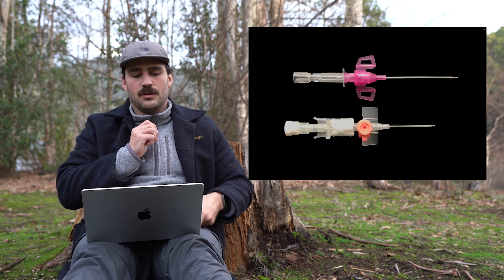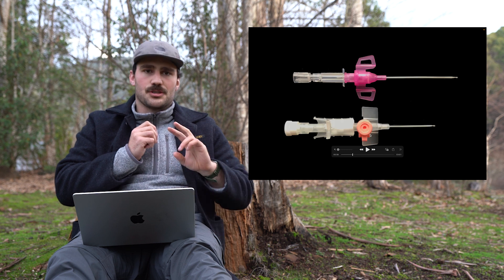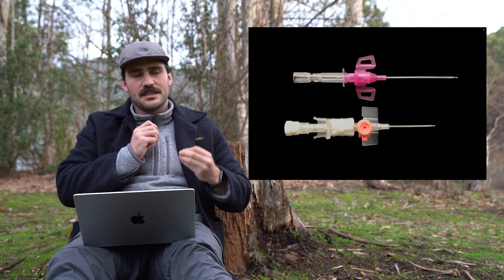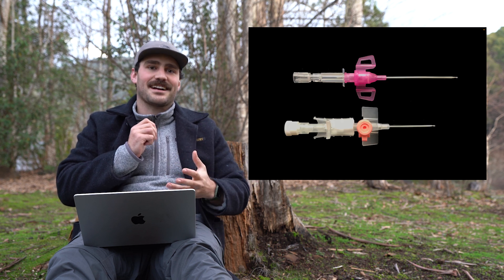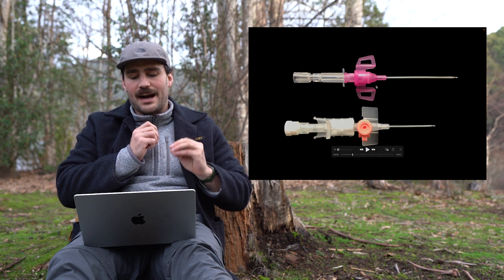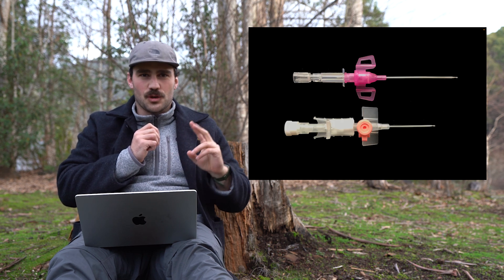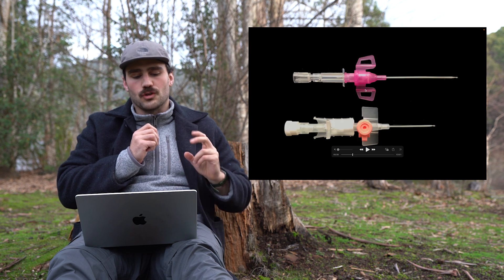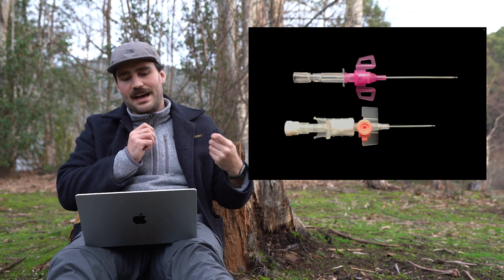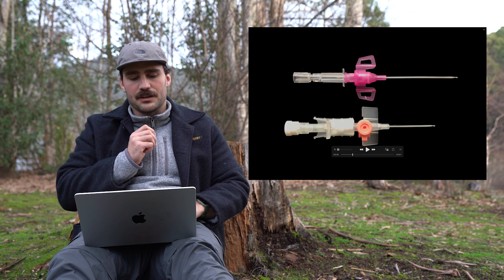We've got some different cannulas shown here. Essentially there are two main parts: there's a needle part which goes in the skin — that's the thing that breaches the skin and gets us access to that vein. Once we have access to the vein, the needle is removed and the plastic tube, called the cannula, sits in. That's what we call the drip — it's the bit of plastic tubing that connects the vein to the outside of the body. Then there's the hub, which is just what we hold with our fingers on either side.